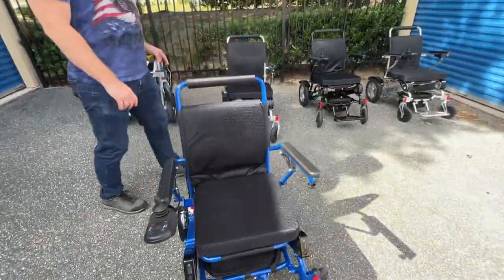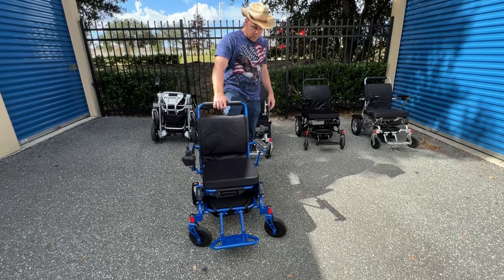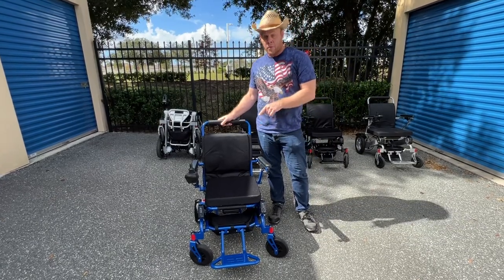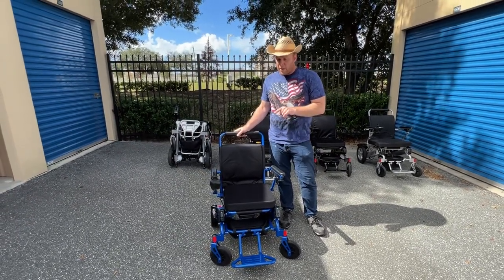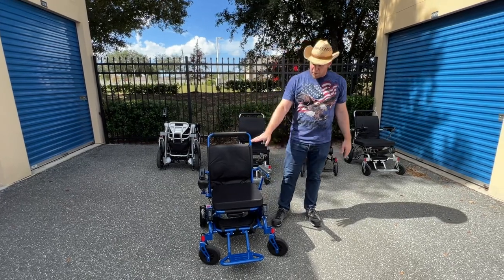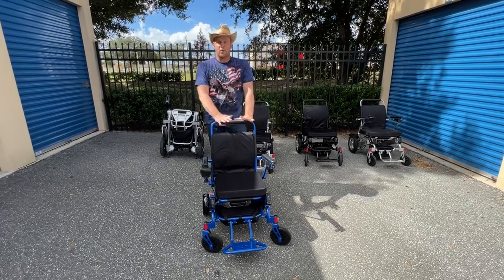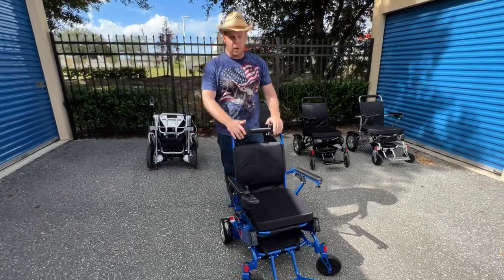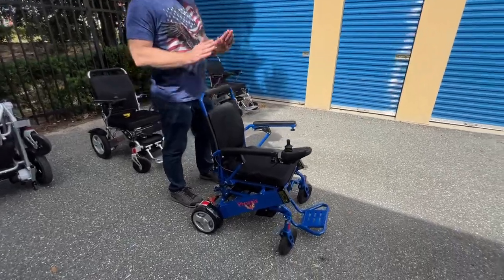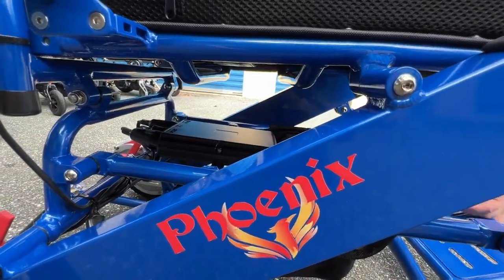You can plug the same charger into the front of the joystick and into each battery individually with the Phoenix — same with the Electra 7, Eagle, and Falcon. The Phoenix weighs 46 pounds without batteries and 54 to 55 pounds with both batteries in — a bit lighter than the other chairs. It's well suited for indoor use, and a lot of people who look at the Airhawk end up deciding on the Phoenix because it has the same design as the HD chairs.